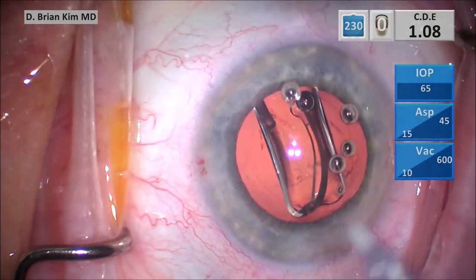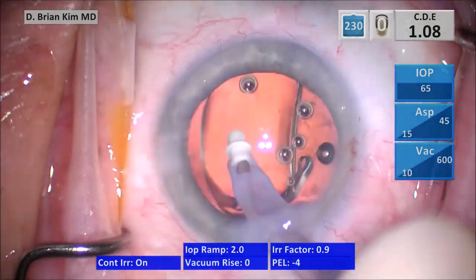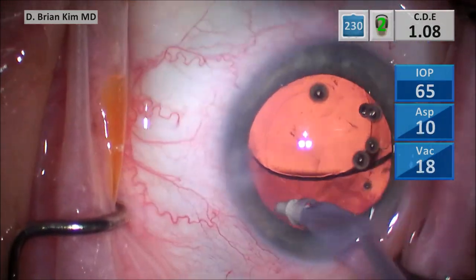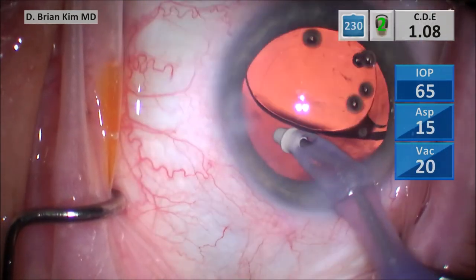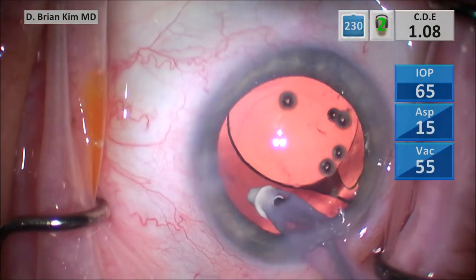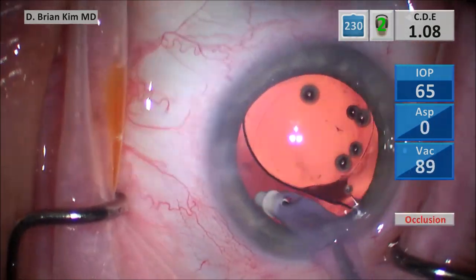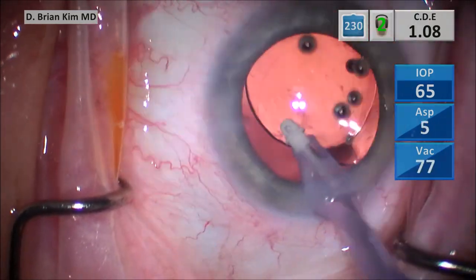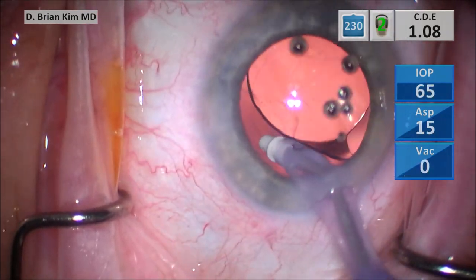I'm loosening and disassociating the leading and trailing haptics from the optic. I rotate the lens 90 degrees clockwise and tilt it in such a way that I'm confident the lens is entirely in the bag. I'm removing some adherent cortical material on the posterior capsular surface in the sub-incisional area, being very careful to use very limited vacuum as I clean that part of the bag. If you're not confident in your foot pedal control in this situation, it's better to switch to the polish mode to remove that small amount of cortical material.